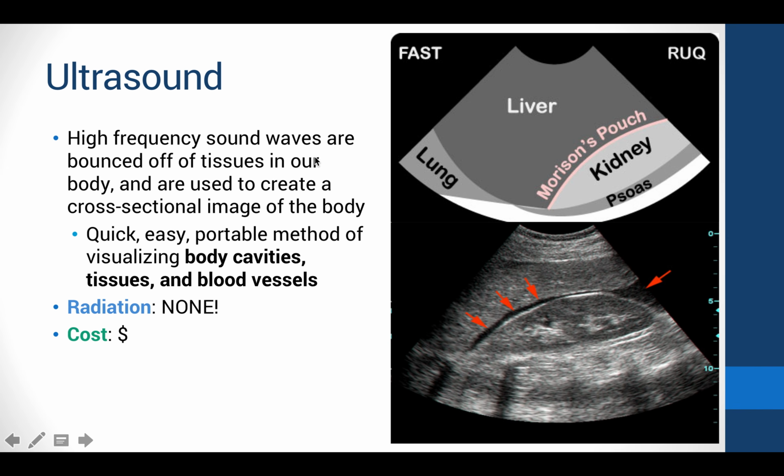Now, because we're using sound waves, there is absolutely no radiation exposure, which adds to the usability of an ultrasound. It's a very cheap test comparatively to CT or maybe MRI. Pretty similar to probably the cost of an X-ray, but there are no radiation costs. So ultrasound is much more frequently used all over the hospital and whatever specialty you're in for diagnostic and procedural uses. So it's a very, very useful imaging modality and one that you should definitely be familiar with.